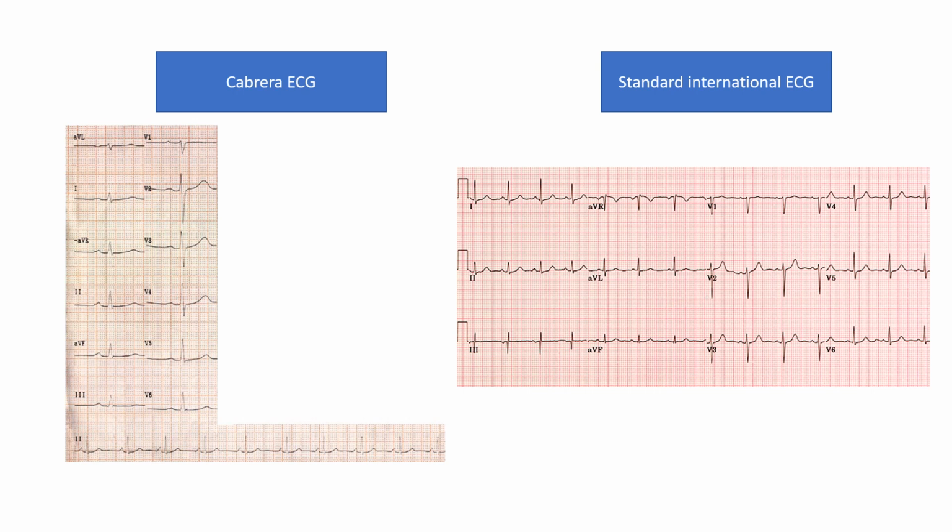And I used to hate this. And I still think that when this one is so popular, we should at least be able to convert between the two on our computers, right? Then there wouldn't be any discussion. But at least at our hospital, we cannot convert. So I've had to learn this, as any doctor who comes to Sweden, and that's okay. It's much more logical, as I'll explain, and I think that's the strong side of it. That's why, when we remake the system now, we should probably be using this ECG.